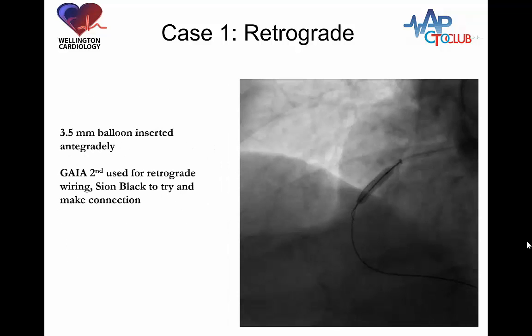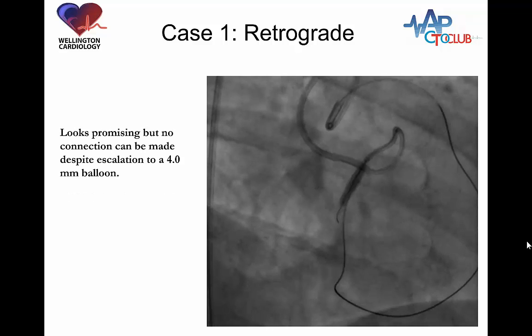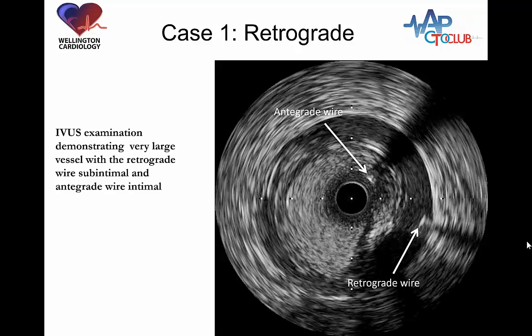We start with a 3.5mm balloon inserted antegradely, then try to make the connection with a Sion Black. This fails, so the usual solution is to upsize the balloon. The balloon is upsized to 4.0mm — it looks promising, but again no connection can be made. With trouble performing the reverse CART despite use of the guidewire, it was time to do an IVUS-guided reverse CART. An IVUS catheter is advanced antegradely, confirming the antegrade wire is in the true lumen and the retrograde wire is in the sub-intimal space. There is a small tear in the intima and a small connection, but it would be difficult to wire.